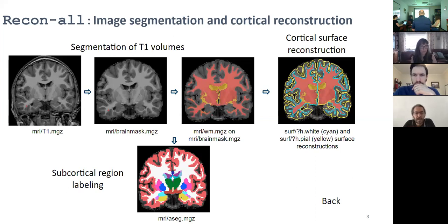That's very cool. But I was thinking of normalization in terms of like an MNI normalization. So basically warping the brain so that it looks a little bit more like an MNI space, something like that. Would that help or hurt the FreeSurfer procedure to be able to do the segmentation? I don't think it would help, simply because they recommend that you don't do that. Okay. The recommendation is that you leave the brain unnormalized in its native space.